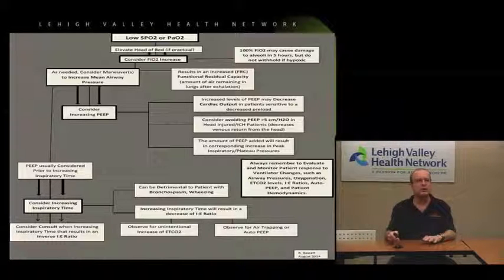You probably want to talk to somebody about that, especially if the patient's not already there, maybe picking up from somebody else's ICU. If they're tolerating it fine, an inverse IE ratio, you might be good to go. You still might want to make a phone call back. But definitely, if you're going to go to that on your own, you probably need to talk to somebody about that. There can be some hemodynamic compromise with that.